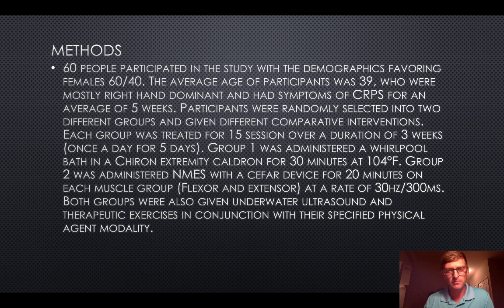so they had to do it for 40 minutes, but 20 minutes for flexor and then 20 minutes for extensor for the electrical stimulation, and it was at a rate of 30 hertz per 300 milliseconds. And like I said, they were both used with ultrasound and therapeutic exercise.